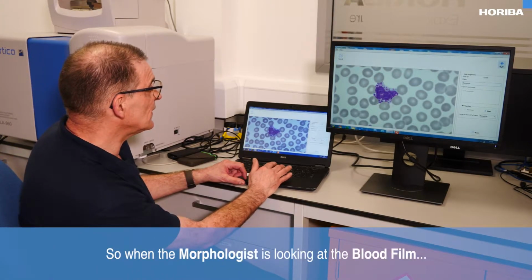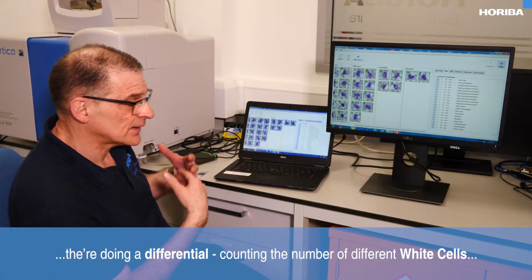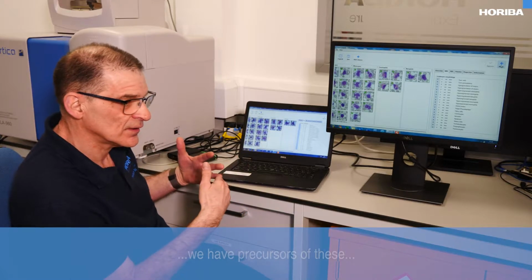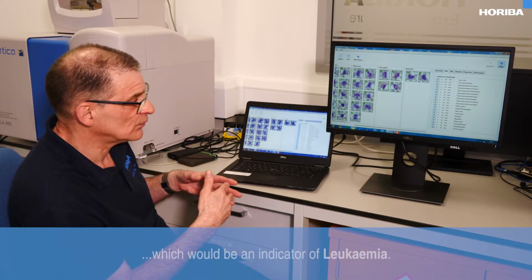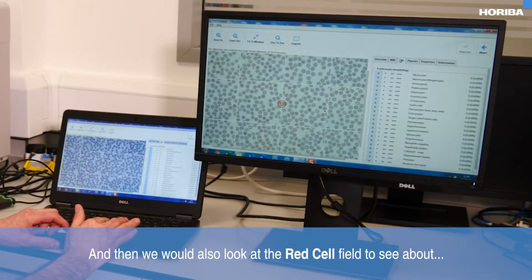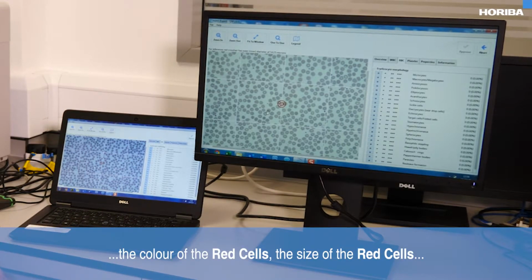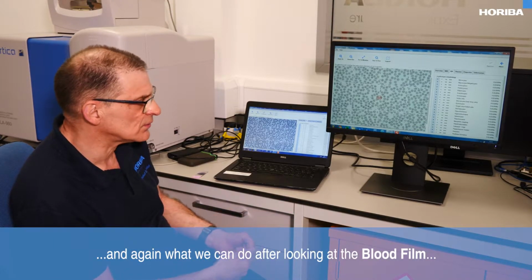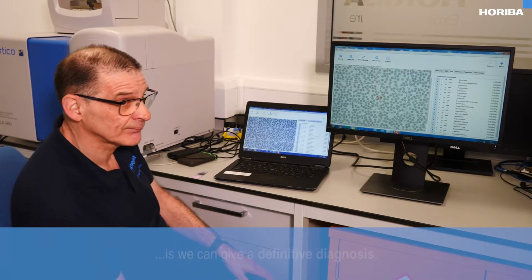So when the morphologist is looking at the blood film, they're doing a differential, counting the number of different white cells. And obviously there's more white cells than this. We have precursors of these, and we're also looking for things like blast cells, which will be an indicator of leukemia. And then we will also look at the red cell field to see about the colour of the red cells, the size of the red cells, the difference in shape of the red cells. And again, what we can do after looking at blood film is we can give a definitive diagnosis.